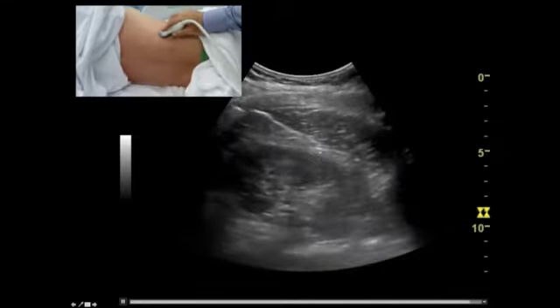And this is what you see. At the front, you see the liver. This is bowel gas with posterior acoustic shadowing, often obscuring that lower pole, particularly when you look from the front. Here's psoas. Here are the vertebral bodies and spine. And this is diaphragm and lung. And that's kidney, nicely framed in the middle there. When you look at the kidney, those are the hypoechoic medullary pyramids.